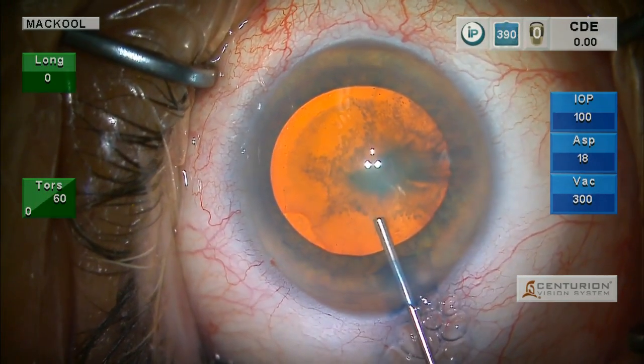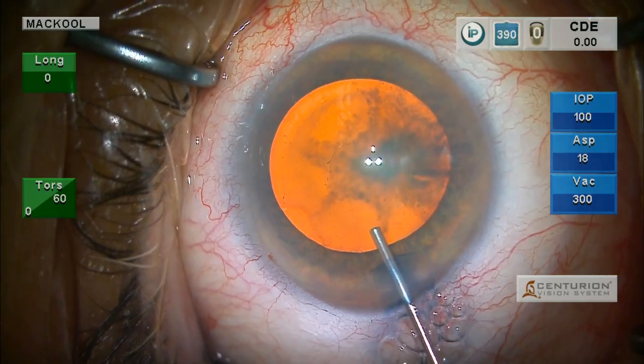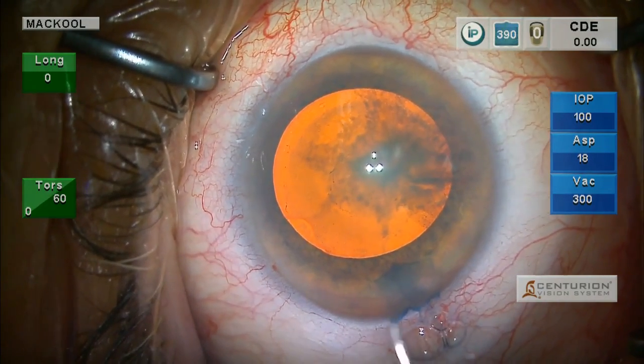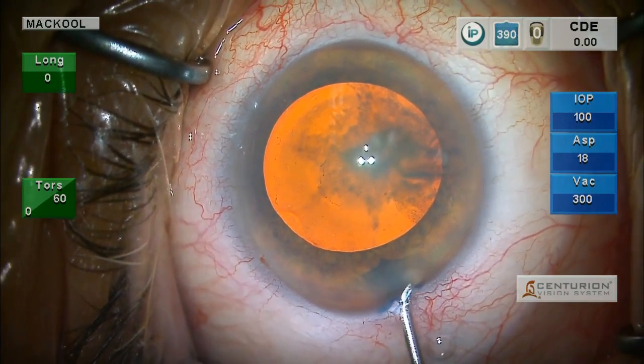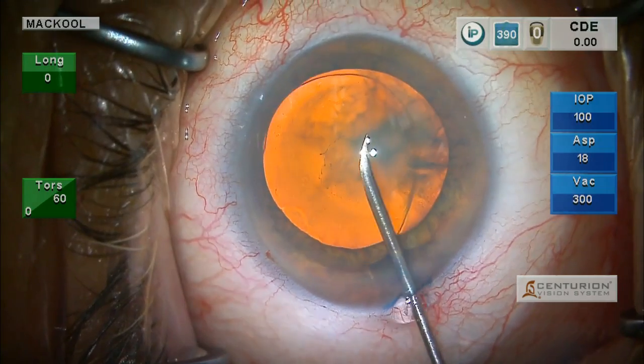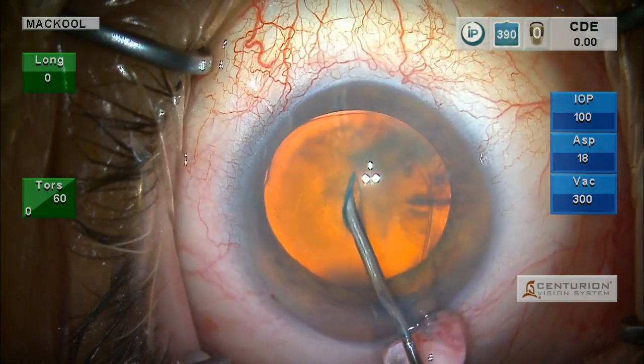Of course, with a lens opacity like this, it'll make it easier to see the capsular edge too. But there's that second reason: to see the capsulorrhexis margins during the procedure in case you need to put in capsule retractors.